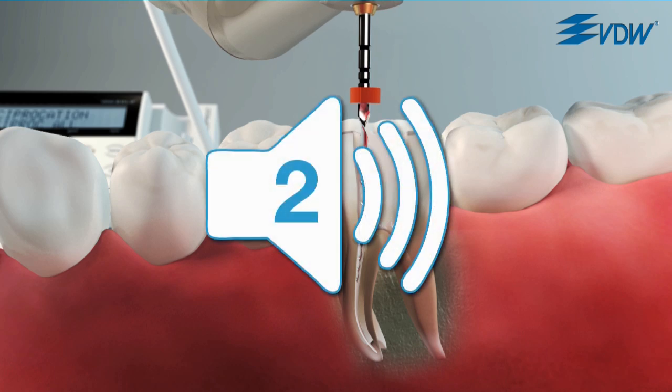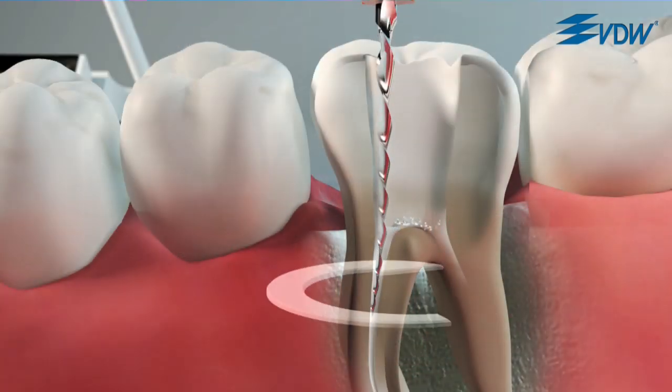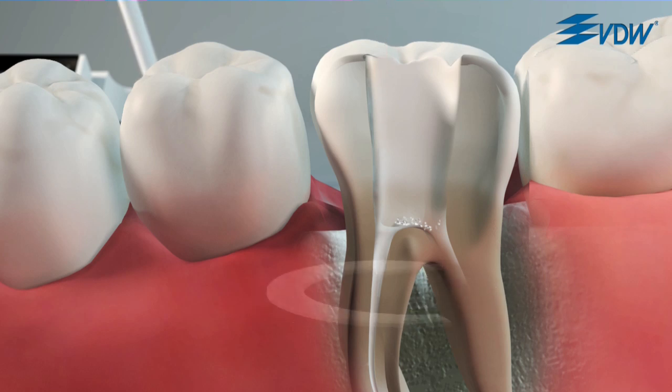If a second acoustic signal sounds, this is an indication that the instrument is subjected to an even higher stress. The motor will automatically switch to a continuous clockwise rotation so that stress on the instrument is immediately reduced.